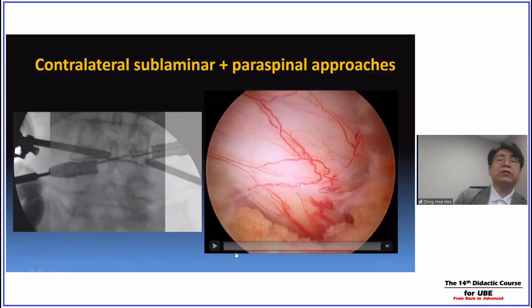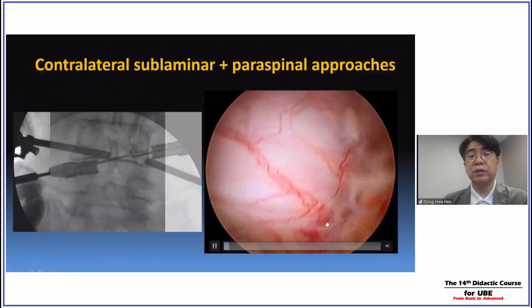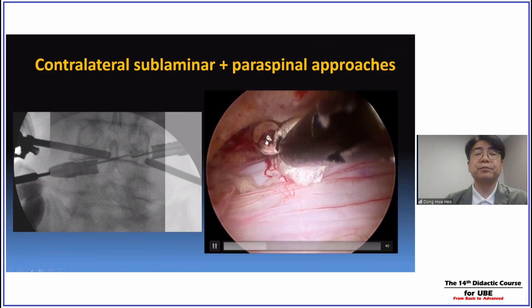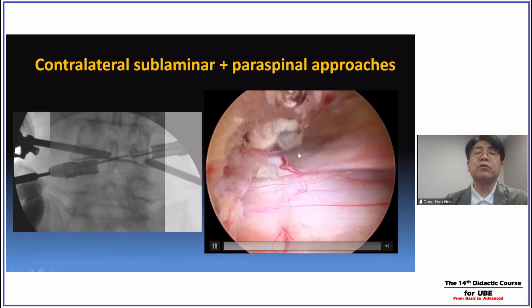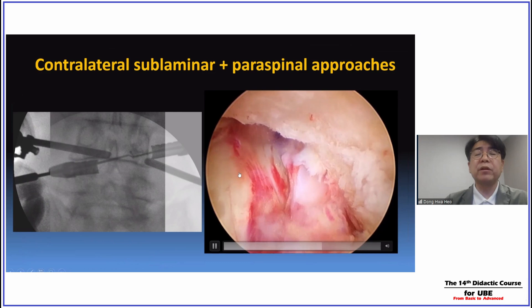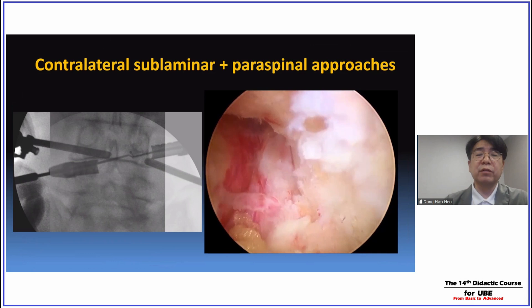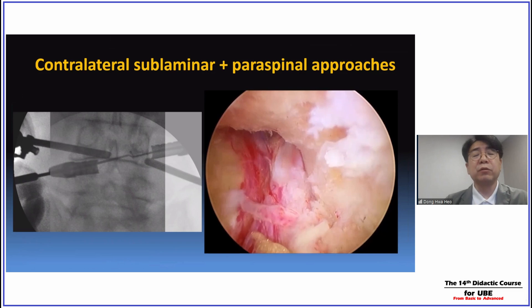Case 4: sometimes I perform a combined approach — contralateral sublaminar with ipsilateral paraspinal approaches. You can see bilateral traversing nerve root decompression, then moving superiorly to the contralateral exiting nerve root. I placed a marked gelfoam piece around the exiting nerve root axilla area, then moved to the ipsilateral side and performed a paraspinal approach for complete decompression of the axilla nerve root, finding the marked gelfoam through the ipsilateral paraspinal approach and achieving complete long-track decompression of the contralateral exiting nerve root.